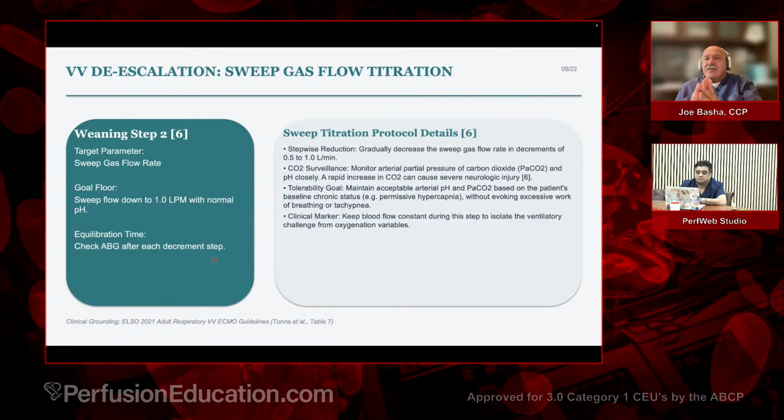And so you have to allow for metabolic compensation, which could take days to a couple of weeks, depending on the circumstances, right? But certainly days, and probably 4 to 5 days before you start seeing enough compensation that you can start coming down on that sweep. So you just have to be aware of that.